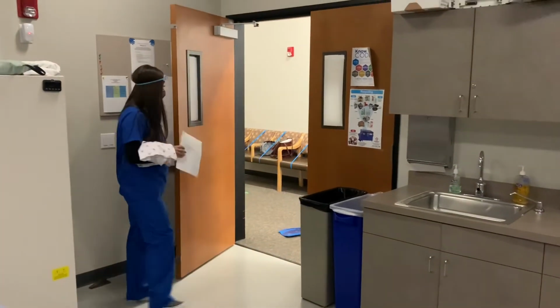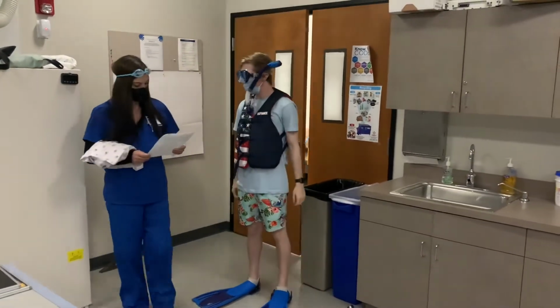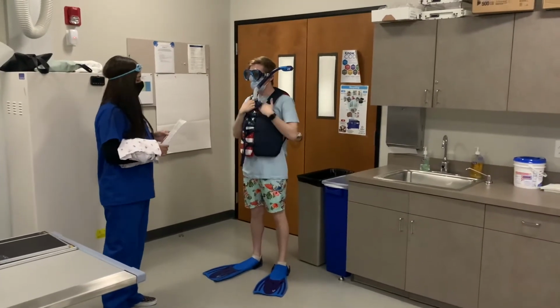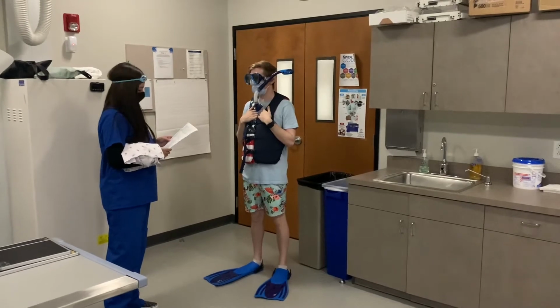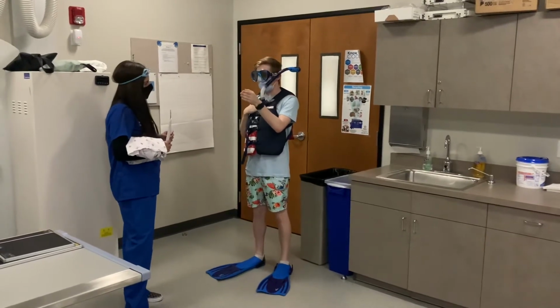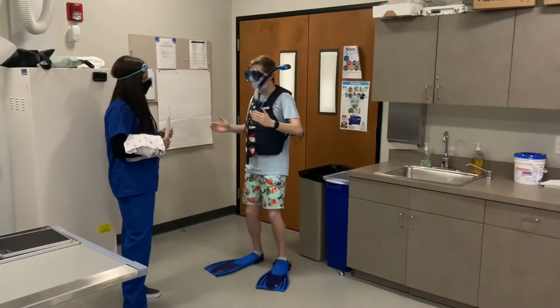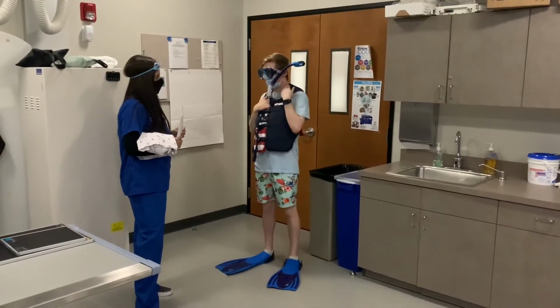Scuba Steve. Hello, my name's Hannah. I'll be doing your x-ray today. Hi. Can I verify your first and last name, Scuba Steve, and your medical record number? 3464380. Perfect. All right, what brings you in today? I was free cage diving with sharks out in Bodega Bay, and one just really snuck up in my periphery, and I turned like that, actually in my neck, to see it. I must have whipped too hard, and it's just been hurting ever since.